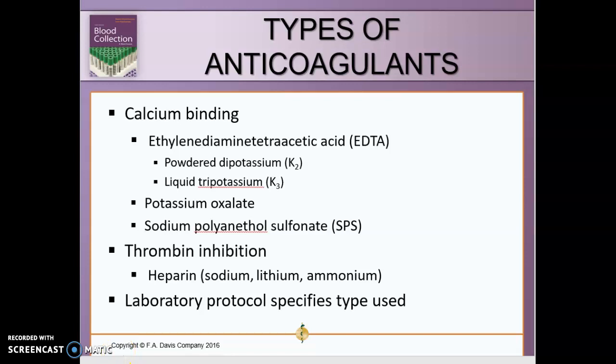Chapter 2, Part 2 video. Today we're going to talk about types of anticoagulants. We have different anticoagulants that are in the tube.